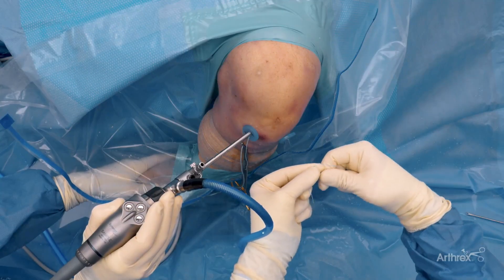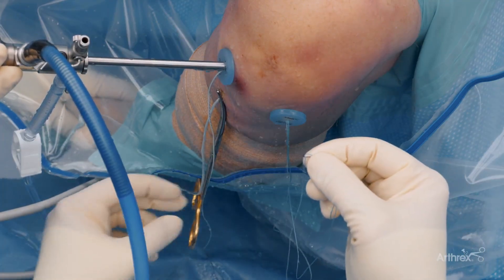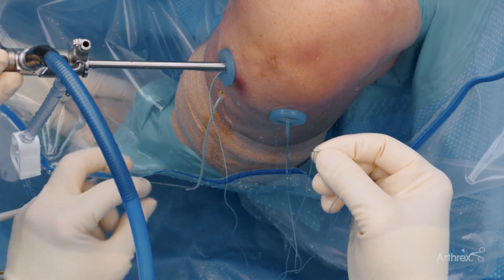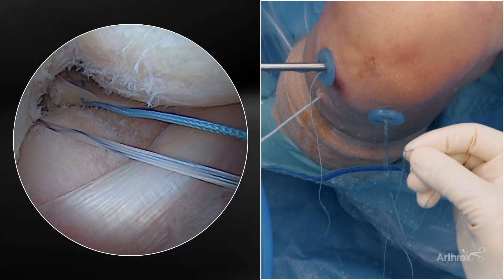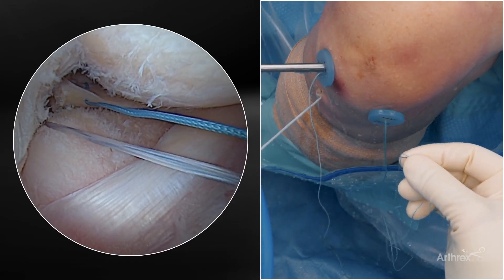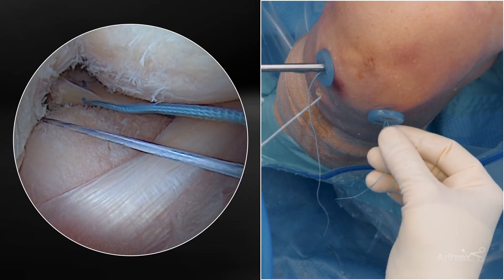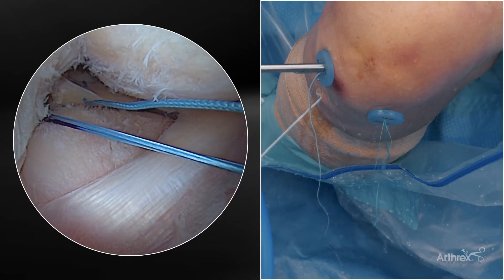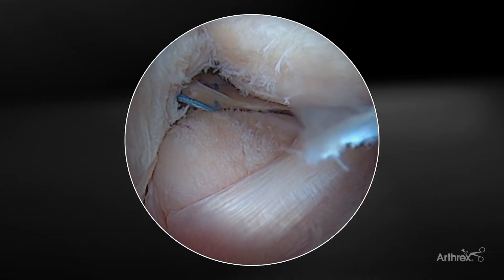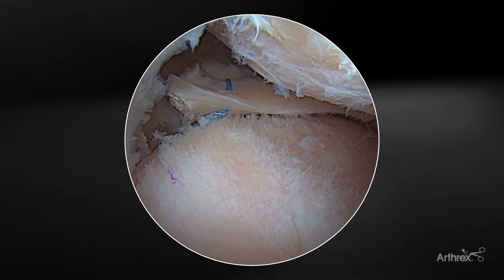We load that to the purple line right here. We're going to take the hemostat off the sheath so that you can then pull the blue and white to affect this conversion. Now I've got the blue and white — it's going to affect the conversion. The purple is right at the loop; we've confirmed that and we're good to go. We don't want to pull it all the way down until we get the other horizontal suture in place to complete the Mason-Allen.